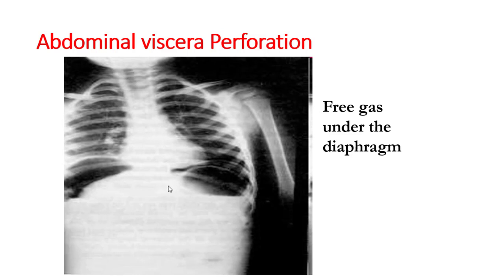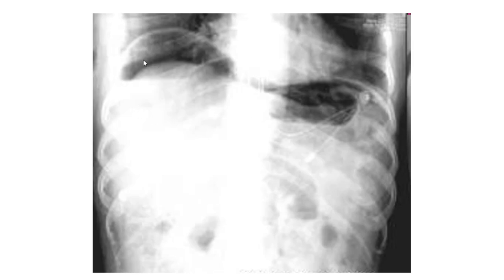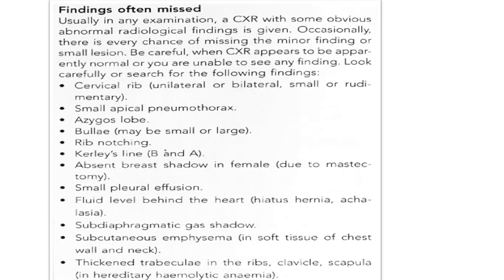Visceral perforation — most commonly stomach or small intestine — results in free gas under the diaphragm on chest X-ray, which should be taken in the erect posture. This gas shadow under the diaphragm is the important finding of perforation of hollow viscous organs of the abdominal cavity.